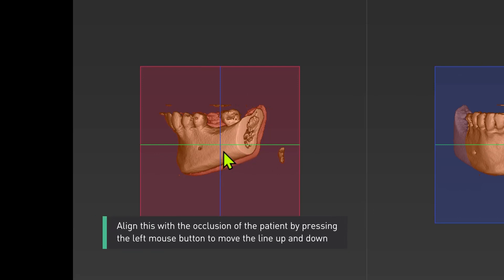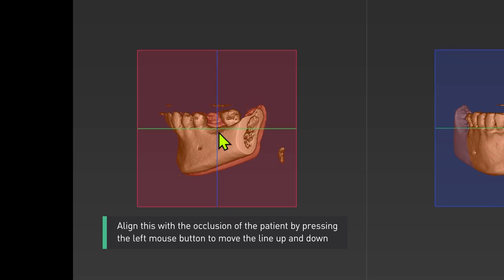Align this with the occlusion of the patient by pressing the left mouse button to move the line up and down.